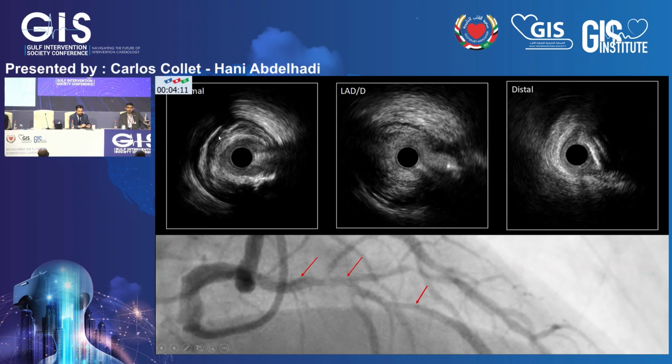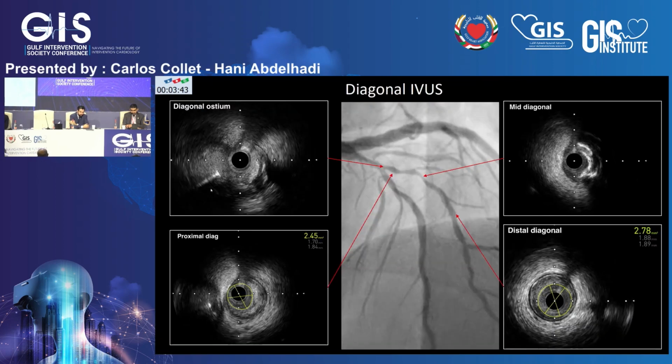And proximally, like Gary Mintz showed almost, believe it or not, 25 years ago, what appears to be angiographically the normal segment actually has a very high plaque burden. In this situation, likely over 70%. So if we were going to go from angiographic guidance and place our stent from this red arrow to this red arrow, we'd be landing into a heavy amount of plaque, with a high likelihood for dissection and a significant increase in target vessel failure.